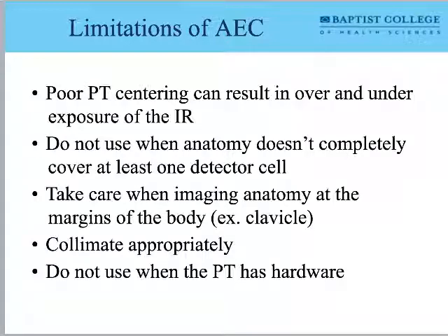It's going to get darker and darker and darker, because if you can imagine, the exposure time you're going to have is beep, oh my crap, what's in his rectum, right? Because the metal in that flashlight is sitting over the photocell, and it's attenuating all those X-rays that should be getting to the photocell and terminating the exposure. So any kind of metal hardware in the area that an AEC is being used is going to wind up in an overexposure. That's a really crass example, but it serves the purpose.